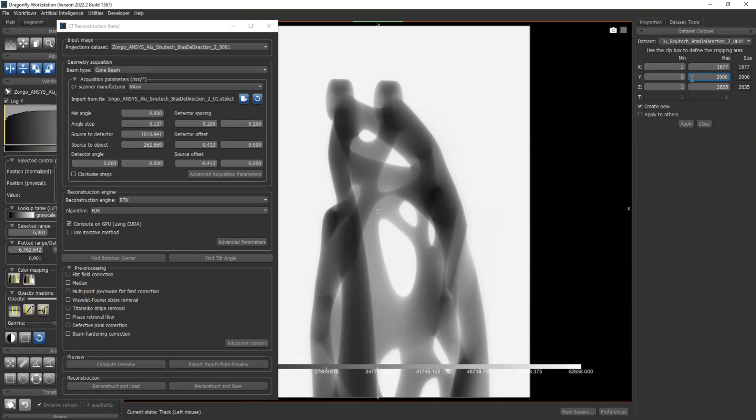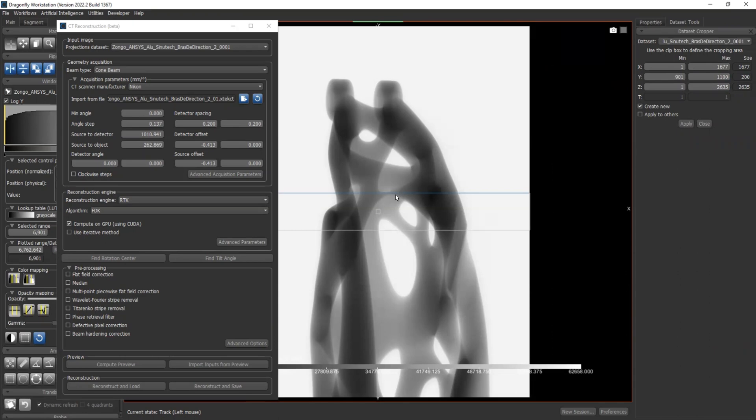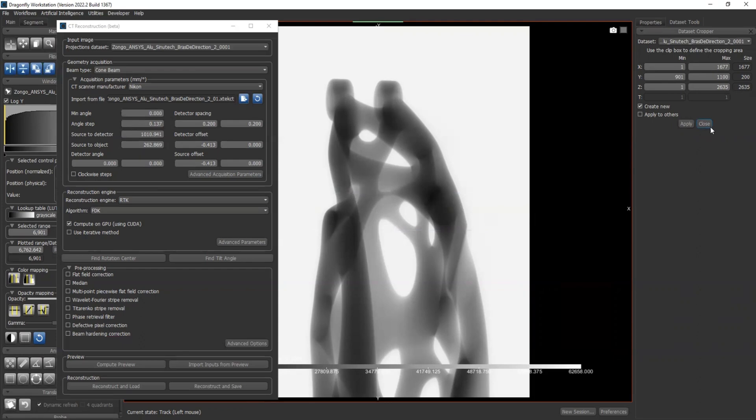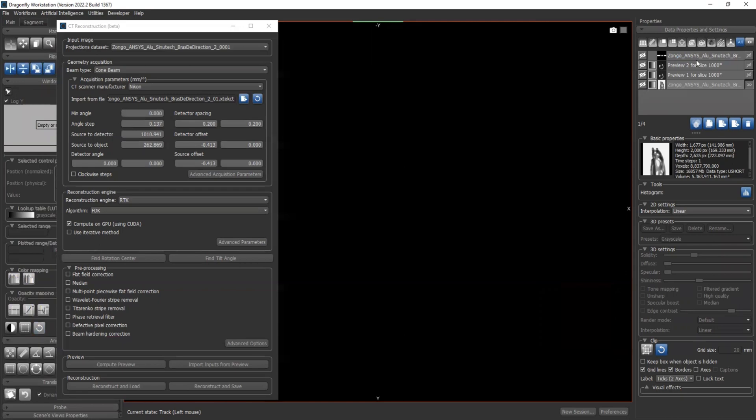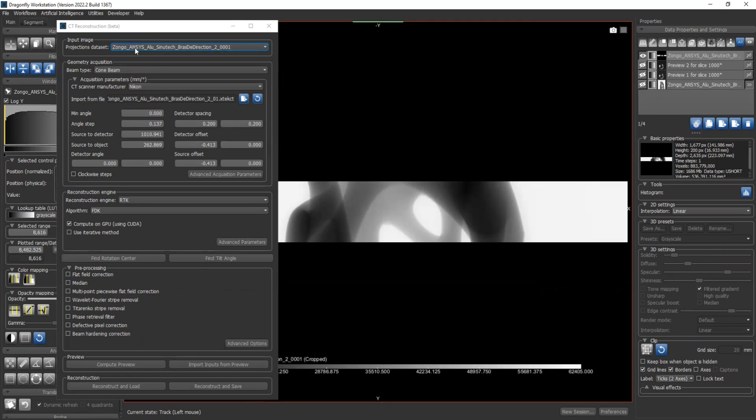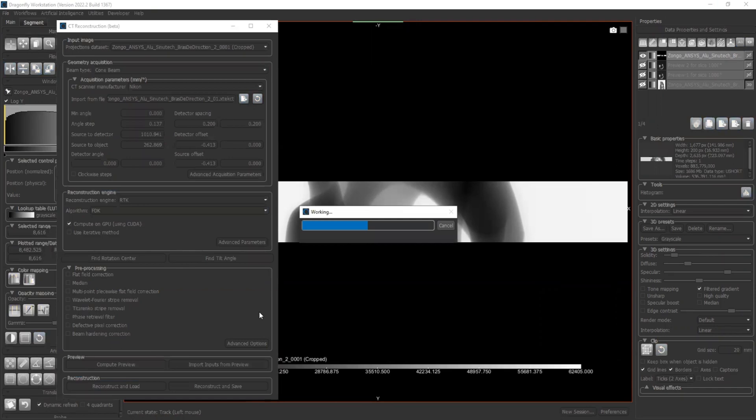So normally you just crop the same number of slices from top and bottom. For example, the original one is 2000 slices. Let's have 200 slices in the middle. So I'm going to have from 901 to 1100 slices. So there's a box over here showing which part you are cropping. Let's say apply. Okay, now I have my cropped dataset here. I can change my projection dataset to the cropped one. And now try to reconstruct and load. It's working.